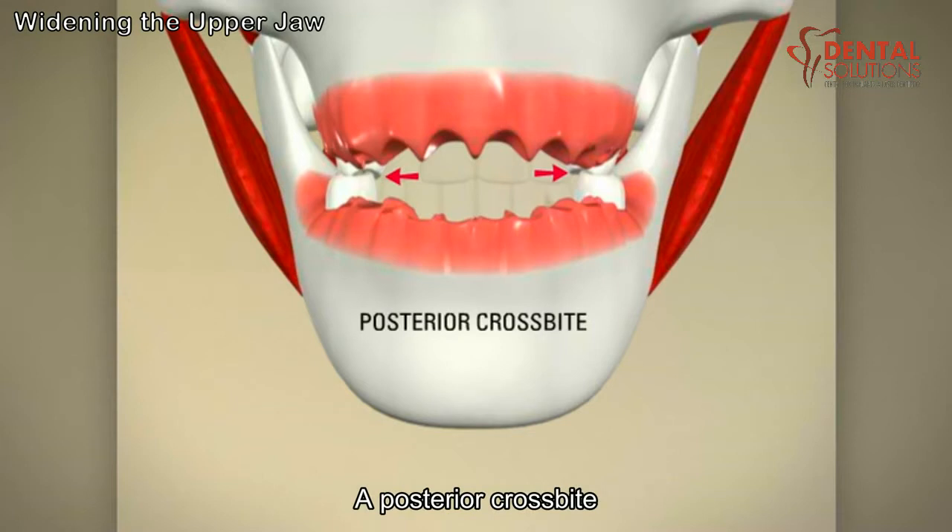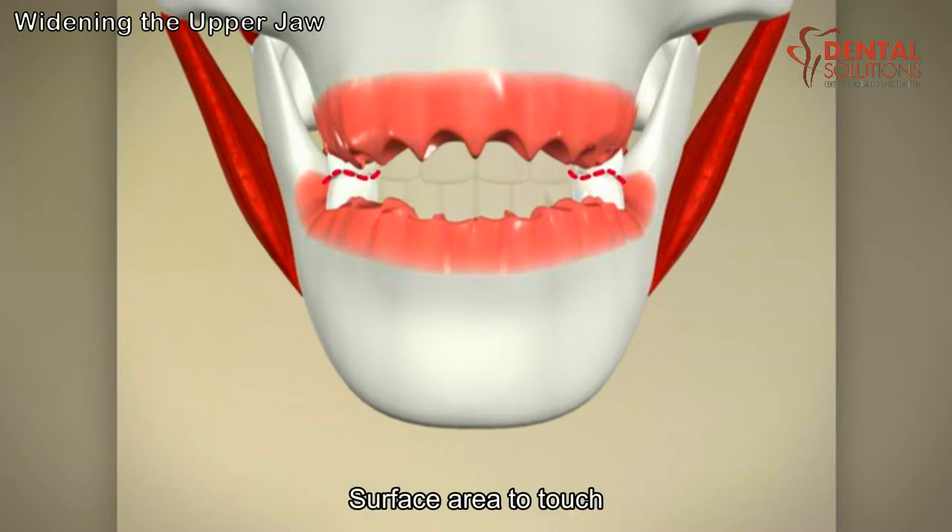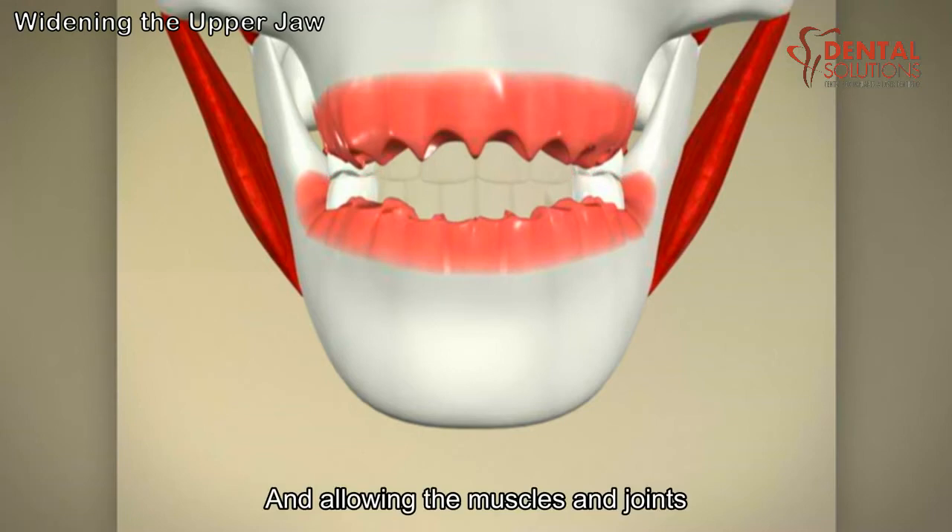This is called a posterior crossbite. In a healthy mouth, the back teeth bite together to allow for the most surface area to touch, enabling you to chew your food effectively and allowing the muscles and joints to work properly.